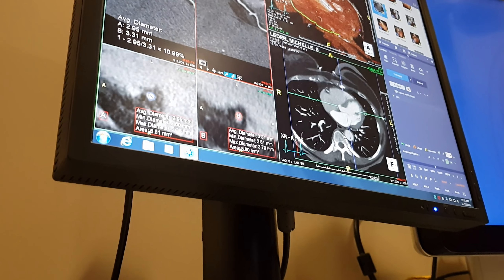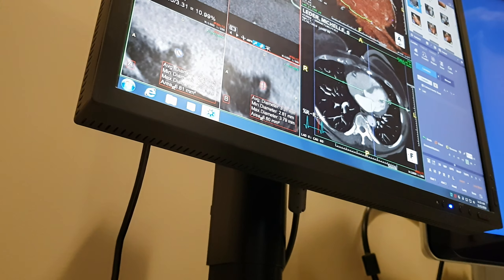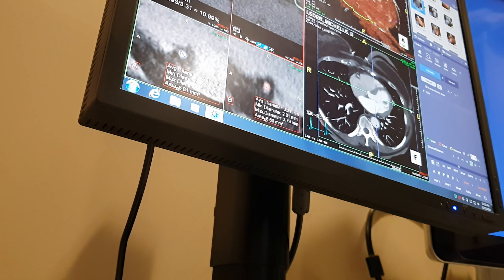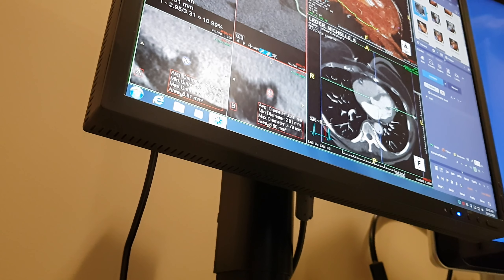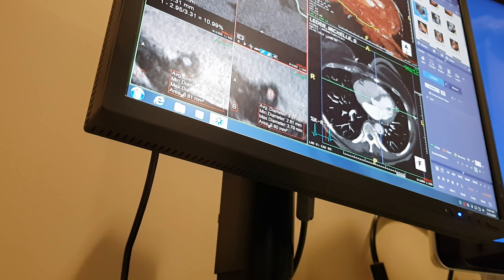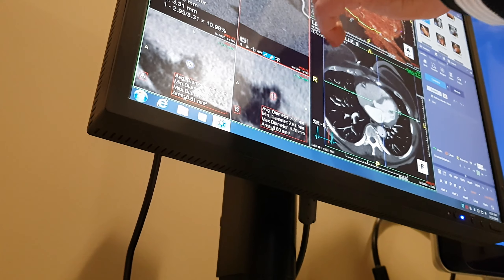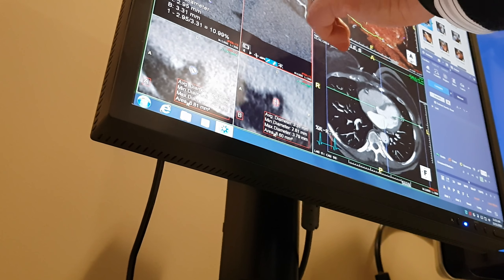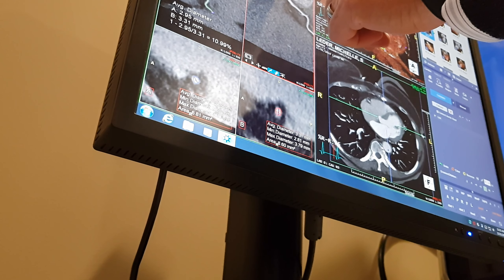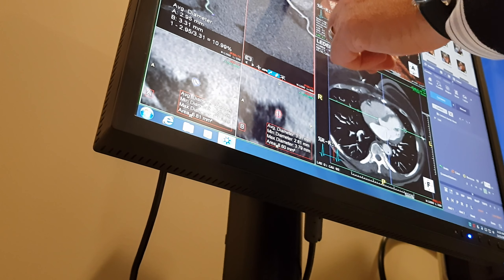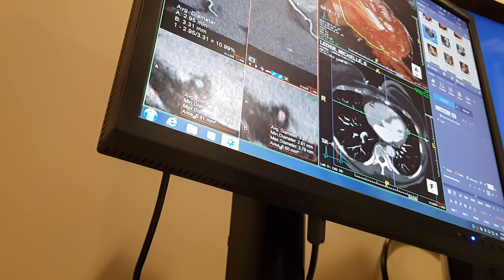So we're rotating around this artery — it's a totally normal looking artery, but look very carefully right in through here. You see how it kind of has a little blip? I'm going to move my hand right here. The white stuff is the artery — forget about this area where the two beats are stitched together — but right under there, it's not super straight on the edge.